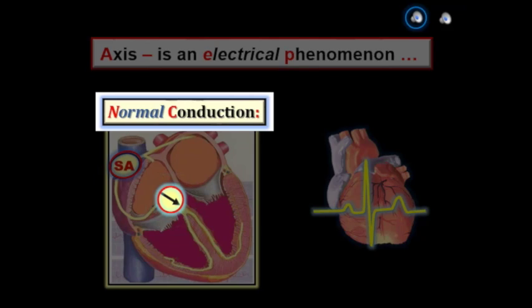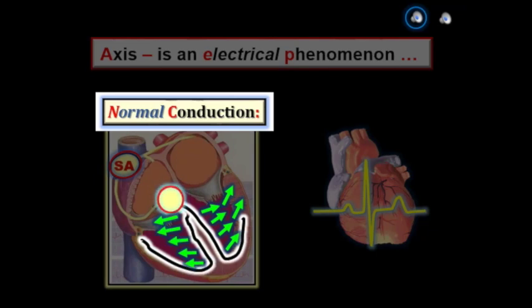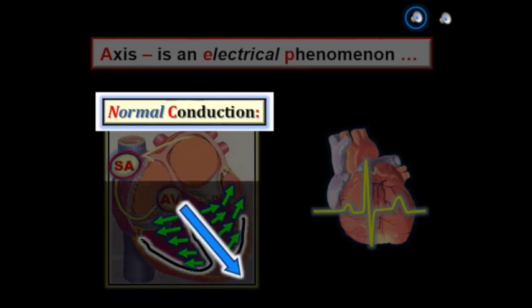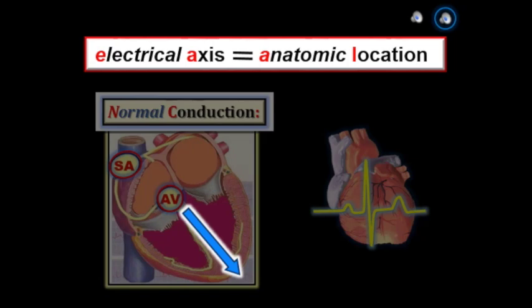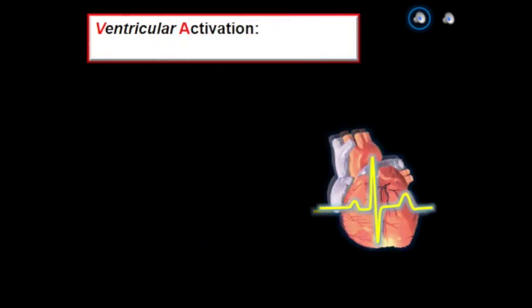The impulse slows down in the AV node, after which it enters the bundle of His and the bundle branch system. This is where ventricular activation begins. Conduction accelerates as the smaller right ventricle depolarizes at the same time as the larger left ventricle. The average direction of this ventricular activation is the electrical axis. Although there is some correlation between electrical axis and the heart's anatomic location in the chest, this correlation is far from perfect.